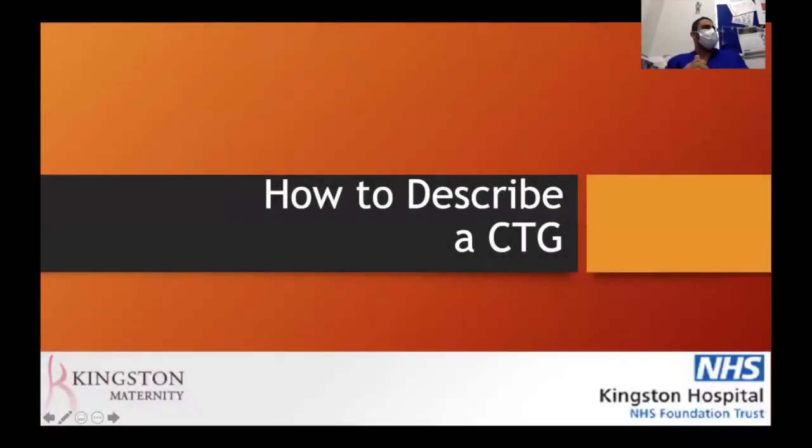We're starting a new team, all new. So it's really tricky to figure out where to start when you're doing just hourly teaching. So I'm going to start out with how to describe a CTG. That's just the basic principle of how we do things around here, because they are slightly different. And also a bit of guidance about how to prepare presentations for the future, because that, again, is a very important thing.